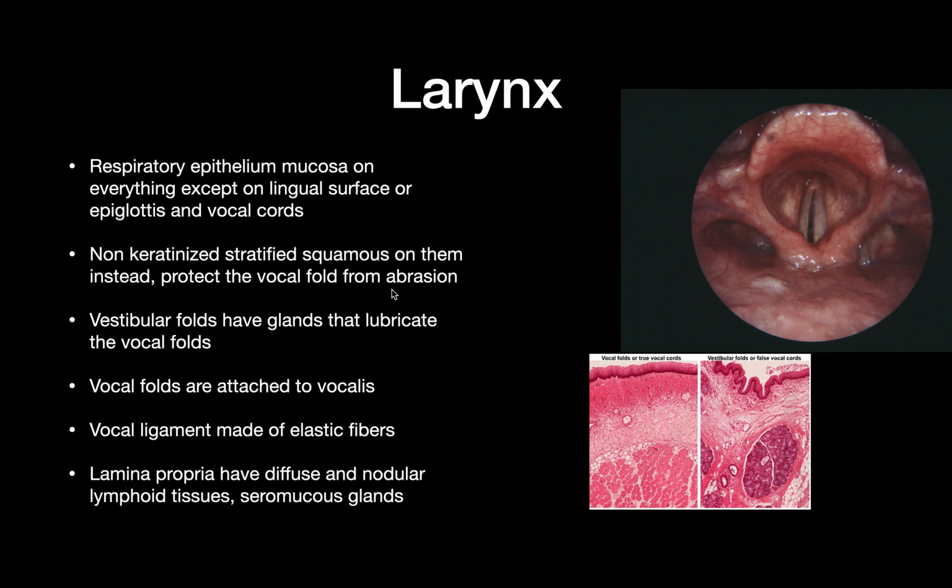So the lingual surface is going to be the tongue. It's covered by other things, of course. The epiglottis is well vascularized, as you can see here, but it doesn't actually have any mucosa, and neither do the vocal cords, of course. So they have the non-keratinized stratified squamous epithelium in order to protect the folds and the other structures from abrasion.